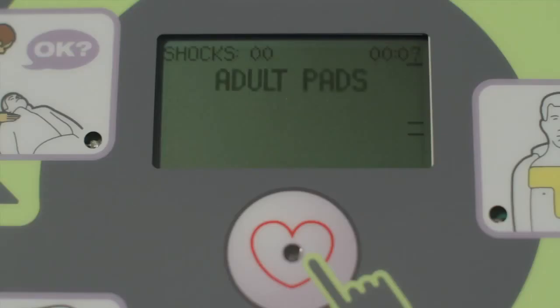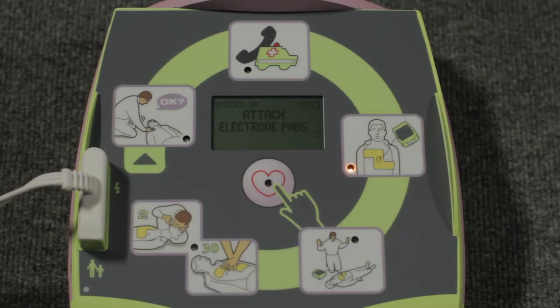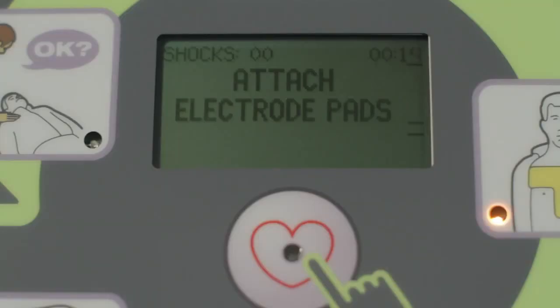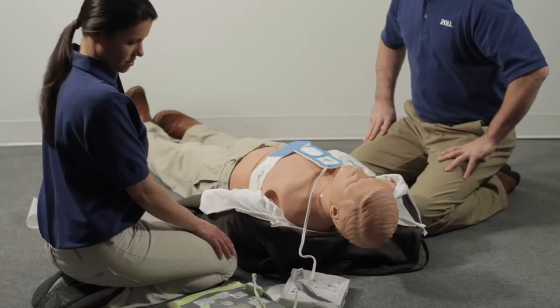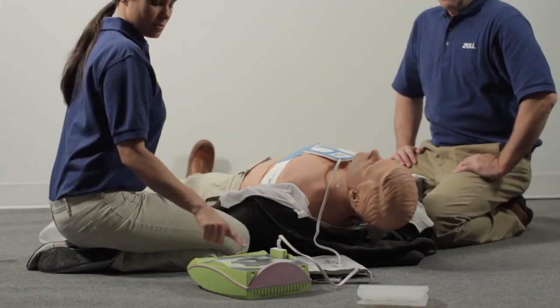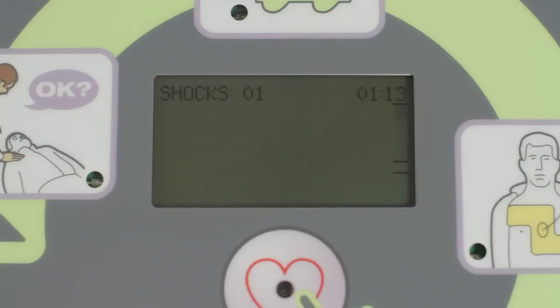Stay calm. Check responsiveness and call for help. Proceed immediately to attach the electrode pads to the victim's bare chest. As soon as they are applied, the AED Plus will begin analyzing the heart rhythm — it will not prompt you to do what has already been done prior to attaching the pads. Don't touch the person while the AED is analyzing the heart. If a shock is needed, be sure no one is touching the person. After the shock, immediately begin CPR — pump the chest 30 times and give 2 breaths. If compressions fall short of 2 inches, the AED will let you know every 15 seconds until you reach the target depth. When compressions become deeper than 2 inches, the AED will again let you know.